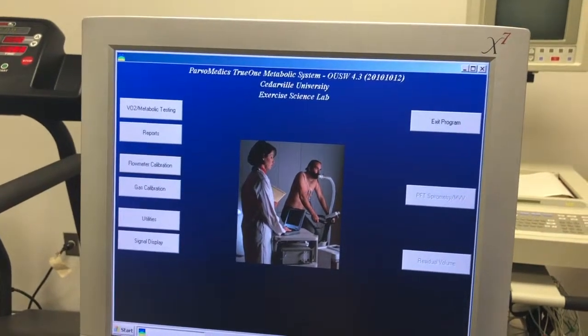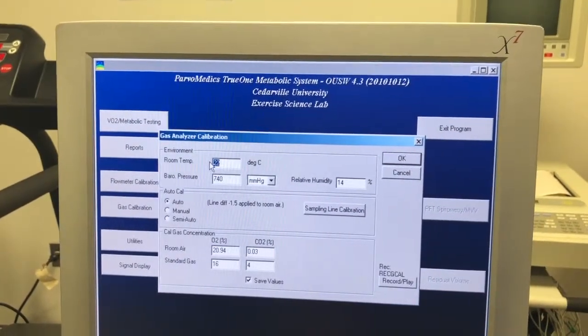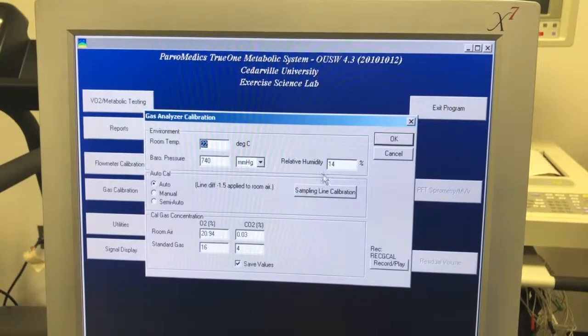The next calibration you have to do is gas calibration. Go ahead and click this button. Same thing as before: input temperature, barometric pressure, and relative humidity.